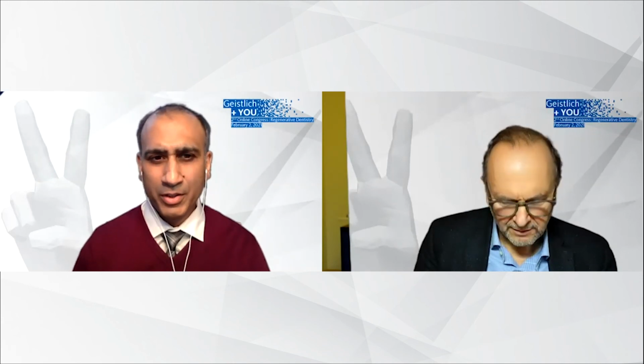The other one is, in the first case, you have seen substantial defects in the root surfaces. How do you treat the root surfaces when you do these surgeries? A lot of it depends on how shallow or how deep the defects are. In this first case, it was relatively shallow, so besides gentle root planing to remove some of the prominences, really not much else. I have started doing some conditioning with PrefGel, but other than gentle root planing, really not much is required.